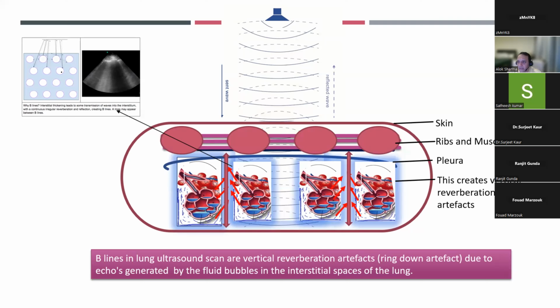These are tetrahedrons. They're in groups of 4 each. Because they're in groups of 4, a sound wave that comes through bounces off and goes infinitely between the tetrahedrons. Naturally, if the sound waves are stuck over here, there's going to be energy over here. Because they're organized vertically in groups of 4, they're going to cause shaking.